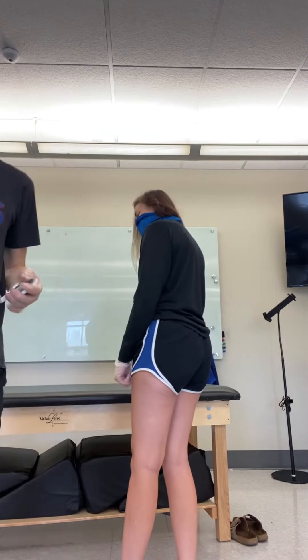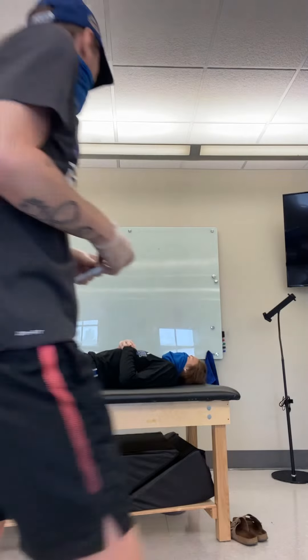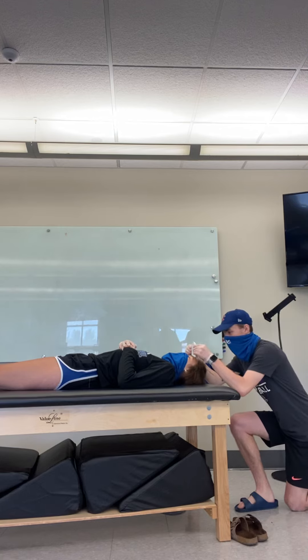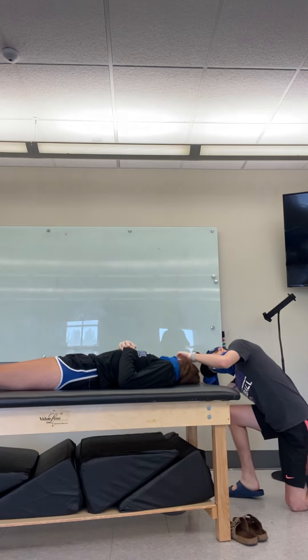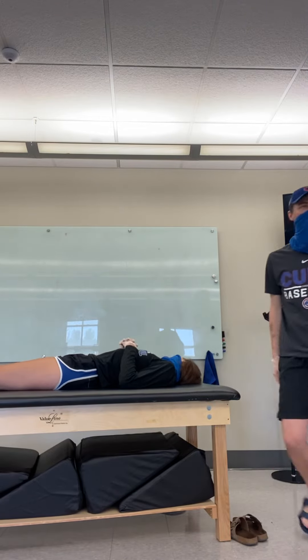For the last one, we'll have her lay down on her back. You're going to put the inclinometer on her forehead and balance it out to zero. Then Hannah, will you rotate your head for me? Go down to that side — it's at about 80. So she's got about 80 degrees of rotation there.